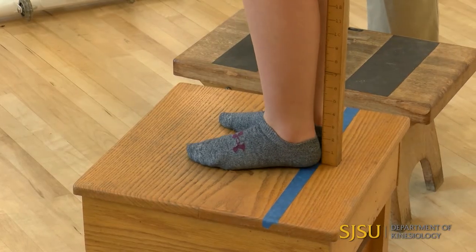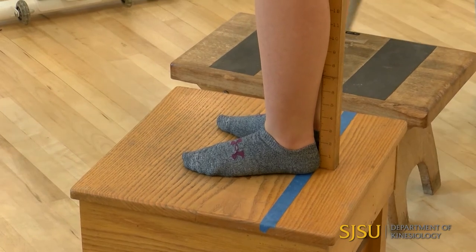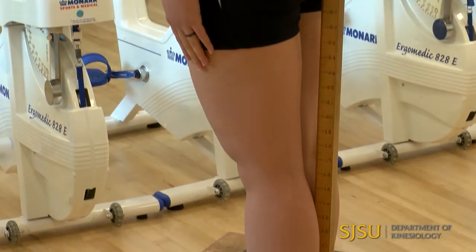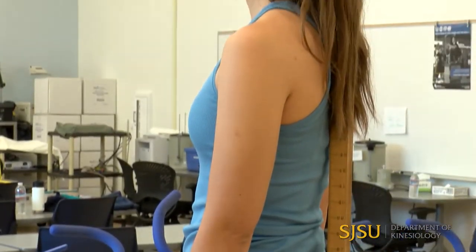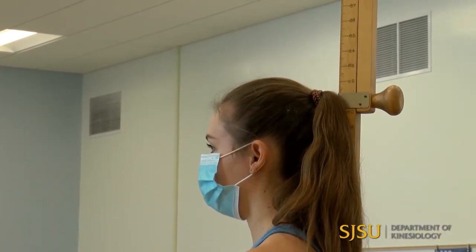We want to ideally have the heels against the vertical bar, her buttocks, her scapula, and the back of her head. However, if some of those sites don't fit, we don't want to have her contort herself. Two locations is fine.